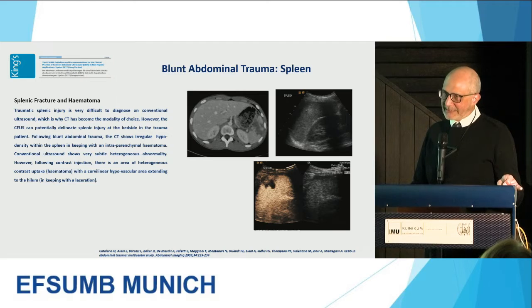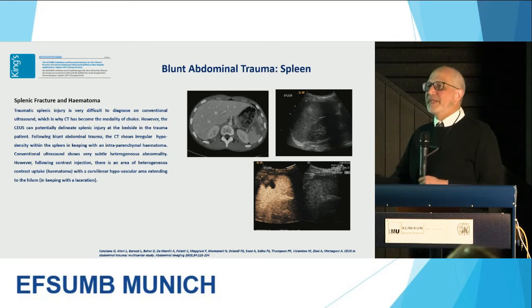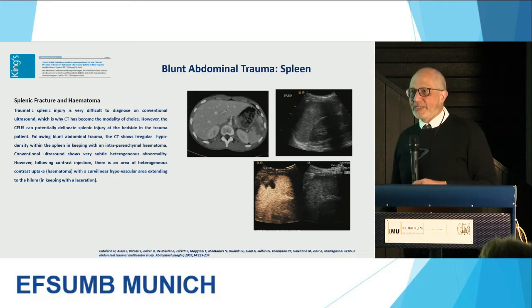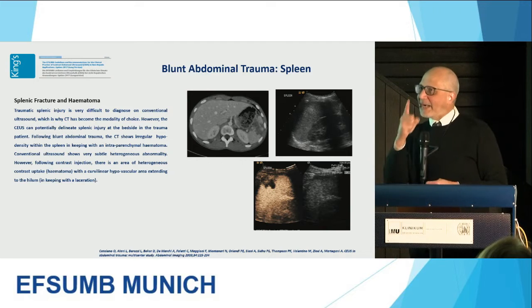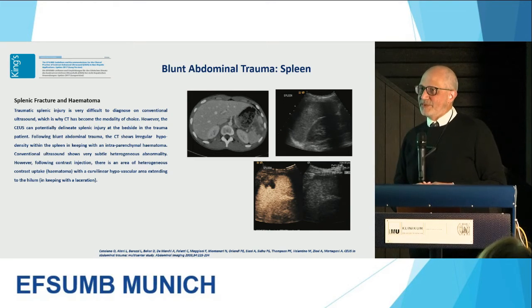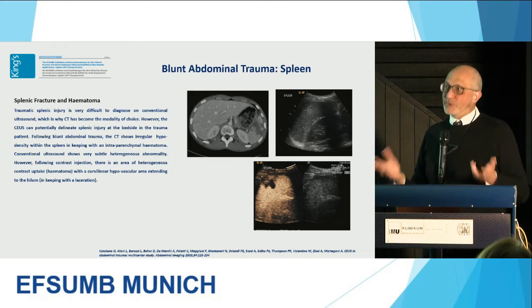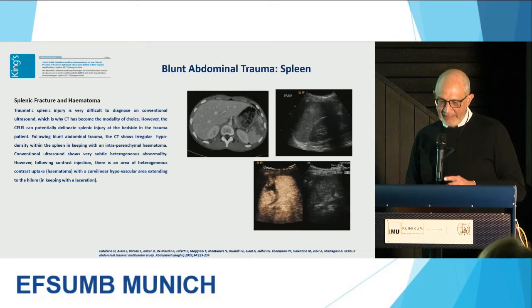For instance, if the liver laceration, you're going to look at that liver laceration over time, so you stop that young adult or pediatric patient having repeated CT examinations and reduce that radiation. There is no point in irradiating the entire abdomen to look at one laceration and is that going to form a pseudoaneurysm. That is almost criminal to be doing that when you have a tool that will allow you not to do it.